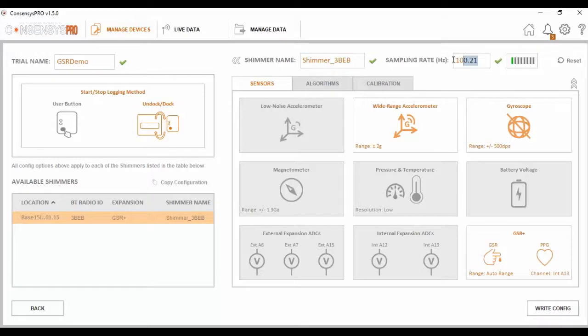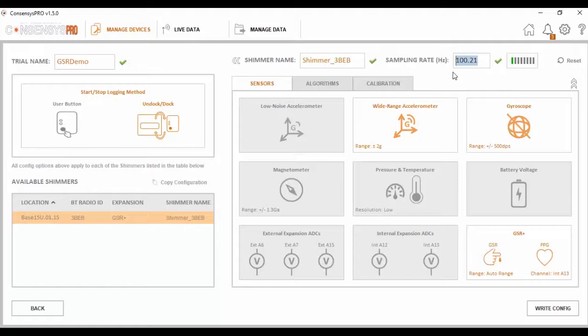The sampling rate can also be set at this point. The sampling rate can be set from a minimum of 1 Hz to a maximum of 2048 Hz. For the purpose of this video, let's set the sampling rate at 20 Hz. This is done by inputting to the box and pressing enter.